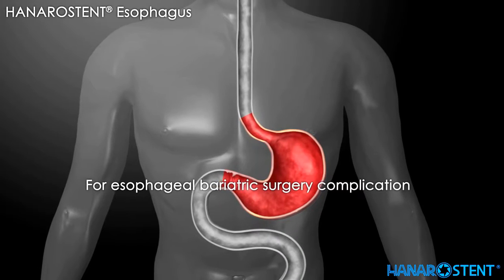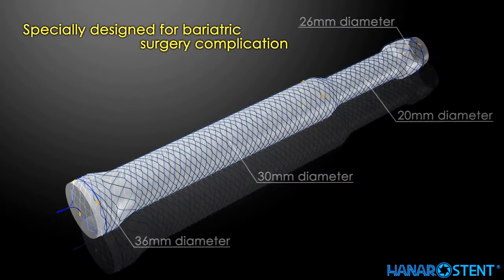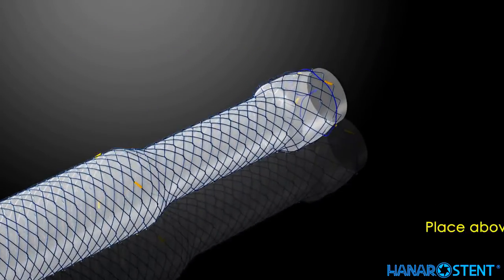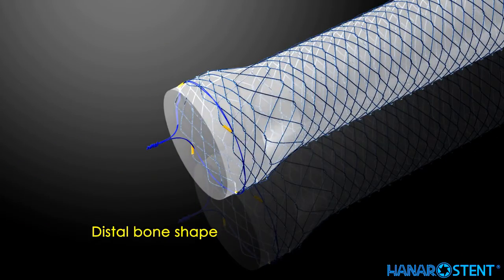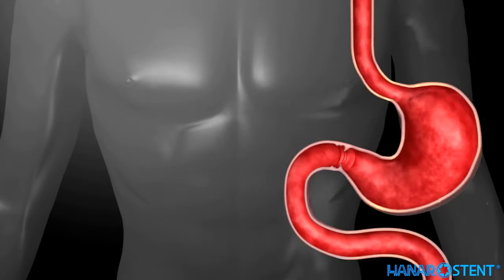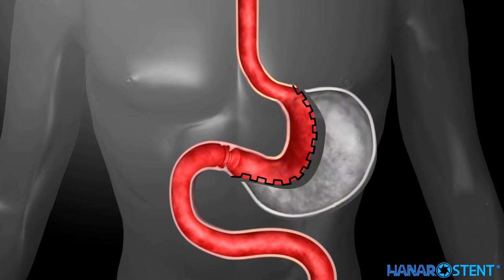For esophageal bariatric surgery complications. Place above the cardia junction. Distal bone shape of duodenum to absorb the peristalsis or to avoid the mucosa to be in contact with the stent.